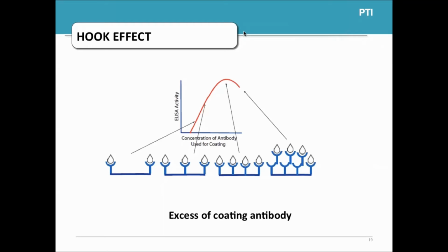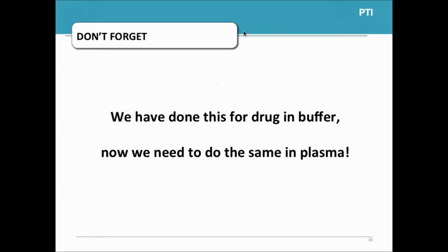This is a demonstration of a hook effect on a coating basis, but a hook effect can happen at any point in your assay and is something that has to be considered, and will also be discussed in more detail.